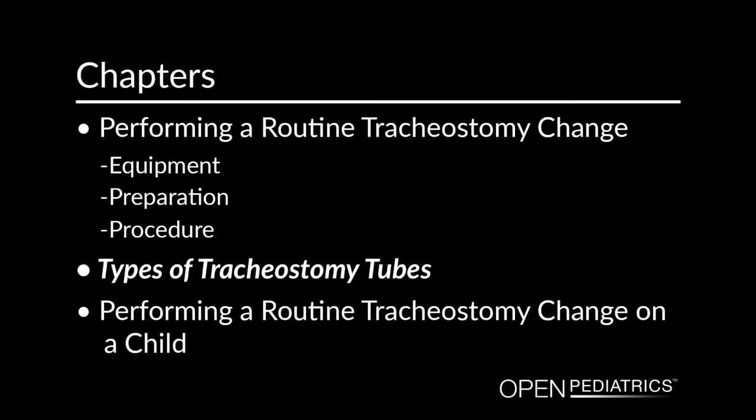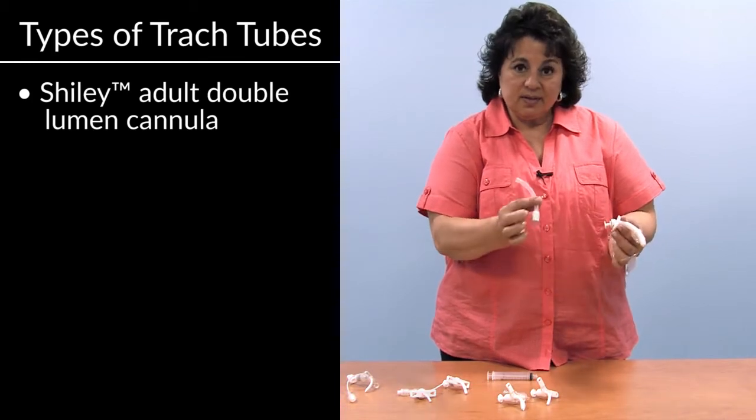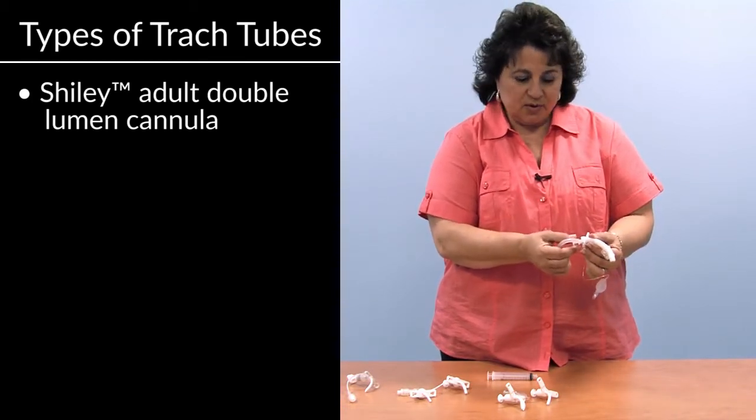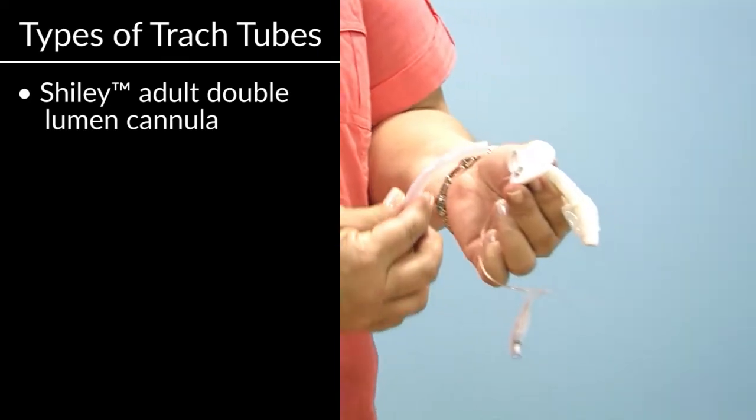Types of tracheostomy tubes. I just wanted to review with you the types of tubes that we are currently using here at Boston Children's Hospital, and that would be the Shiley and Bivona tracheostomy tubes. This is the Shiley adult double lumen cannula tracheostomy tube. This is the obturator that we spoke of earlier when we looked at the other tubes.